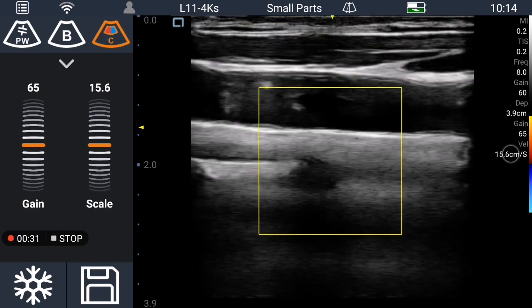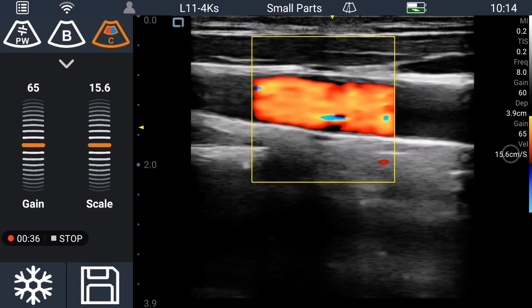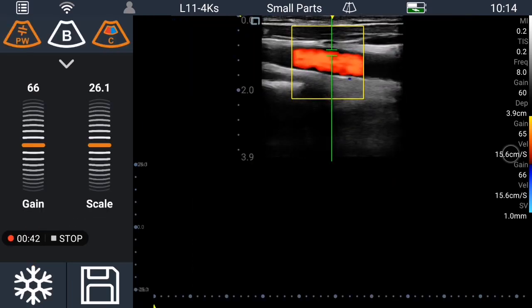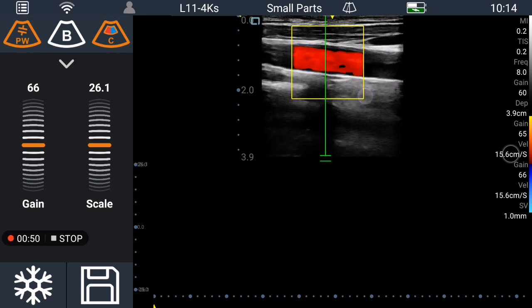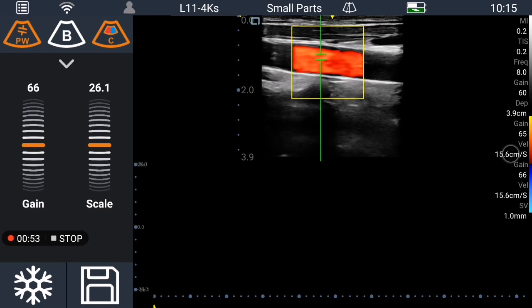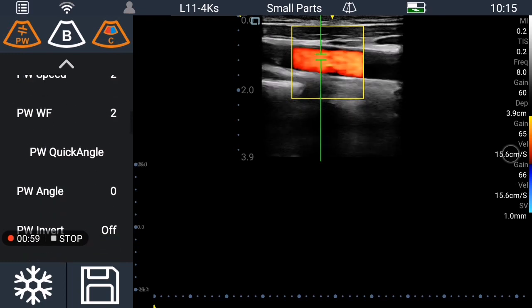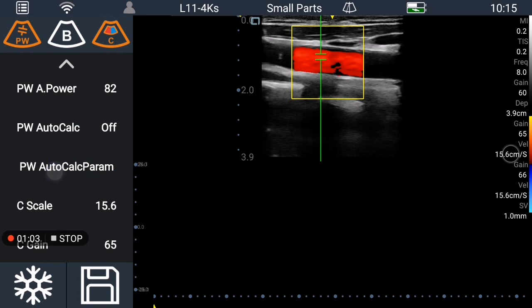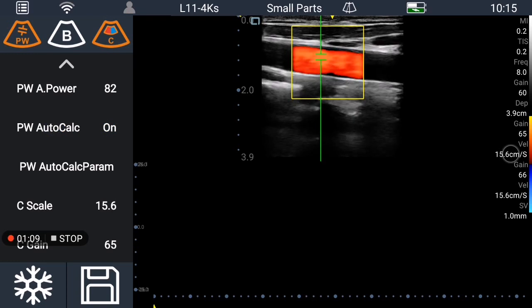Then you need to go to the color mode like this, and then come to the pulse wave Doppler mode. Then you can see the SV, and you can also change the auto calculation parameters in here — you can choose and set them.